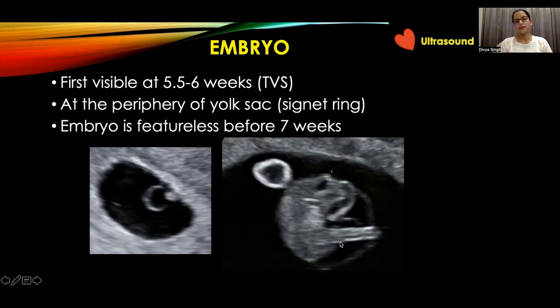Now, this is a bigger embryo, as you can appreciate here, and it is no longer featureless. You can identify that this is the crown, which is identified by the presence of the anechoic rhombencephalon, or the future hindbrain, within it. So if you see this anechoic structure in one end of the embryo, do not get alarmed. This is the normal rhombencephalon, and it helps you in identifying the crown or the head part of the embryo, whereas this diametrically opposite part would be the rump.